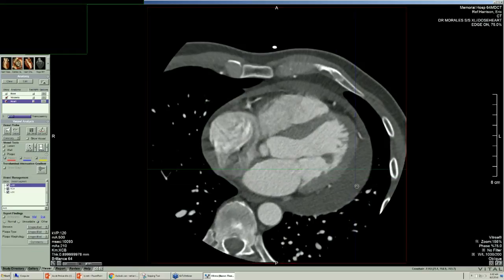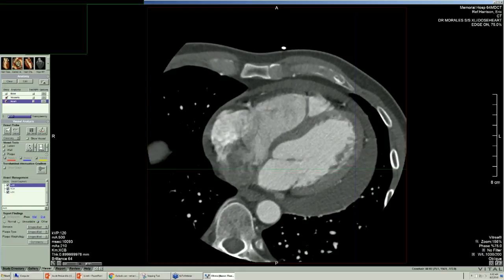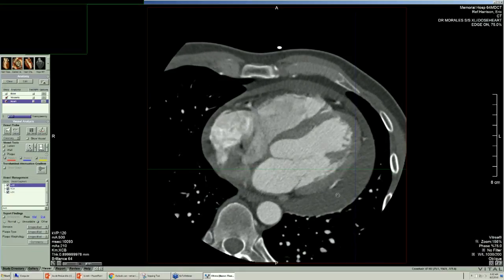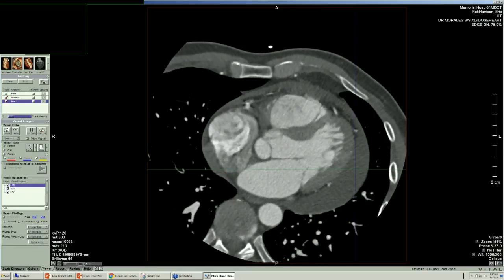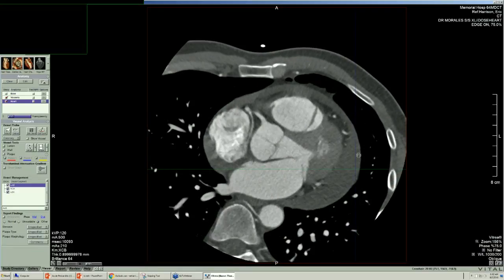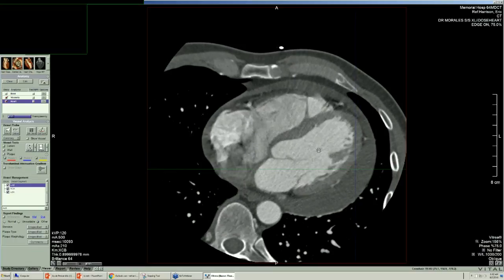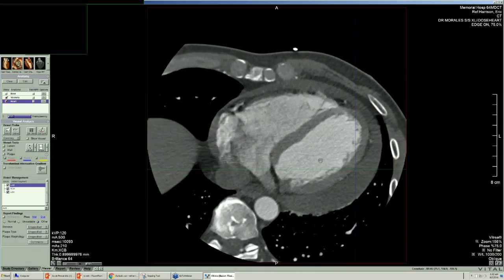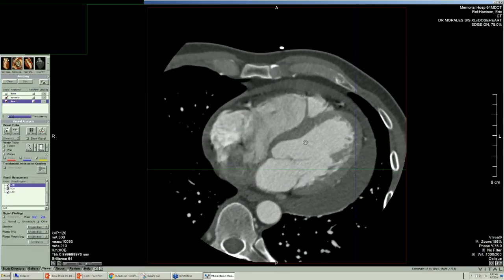And so here's the large pericardial effusion. Person's lying on their back, so the fluid is mostly posterior. Here's the heart. The heart looks great. Myocardium. This is a big space. Everything else looks anatomically intact. So in conclusion, this patient has a large pericardial effusion. He's gone into the subacute chronic phase, and now we're deciding how to treat him more aggressively.